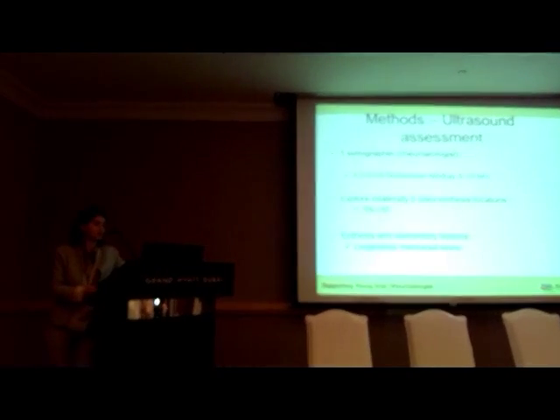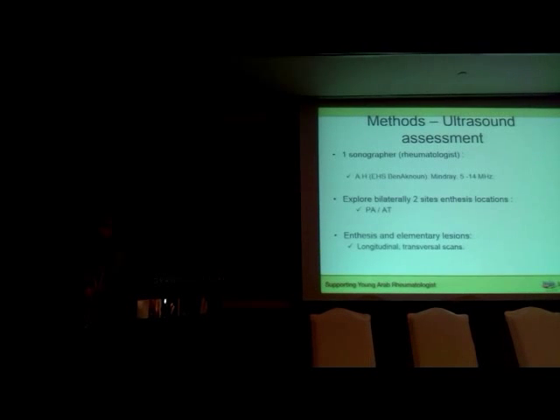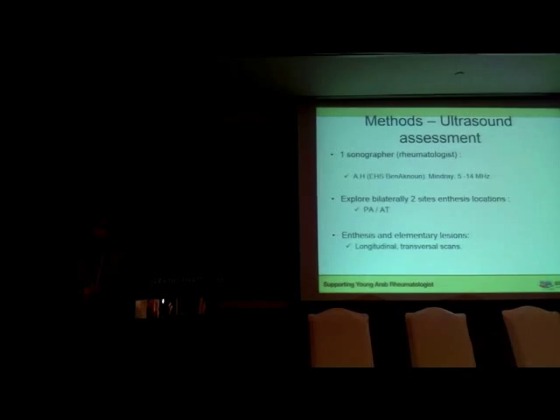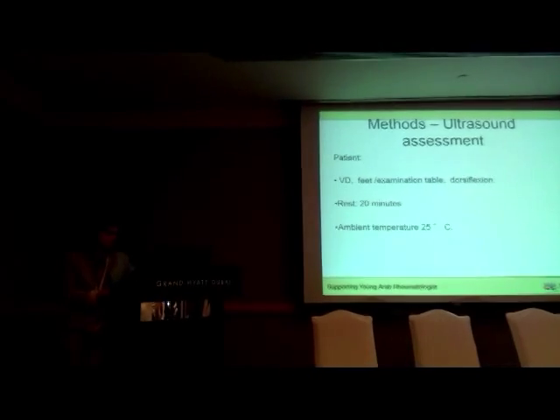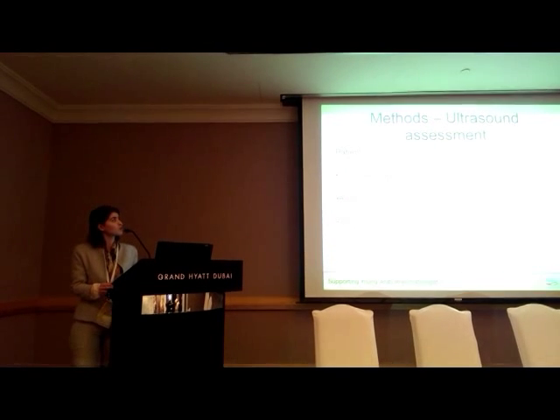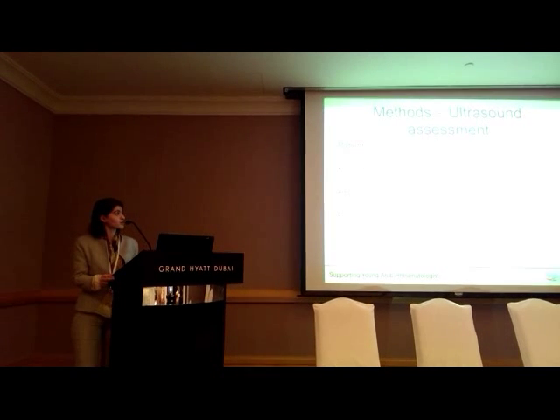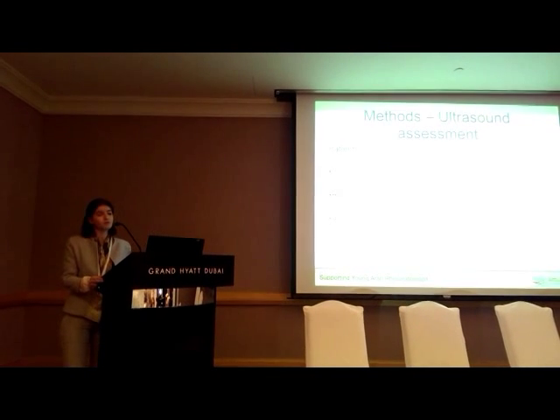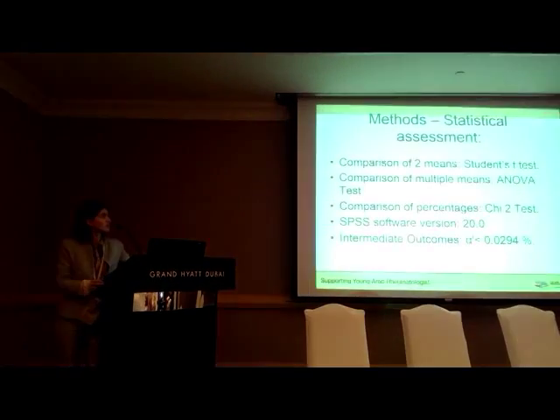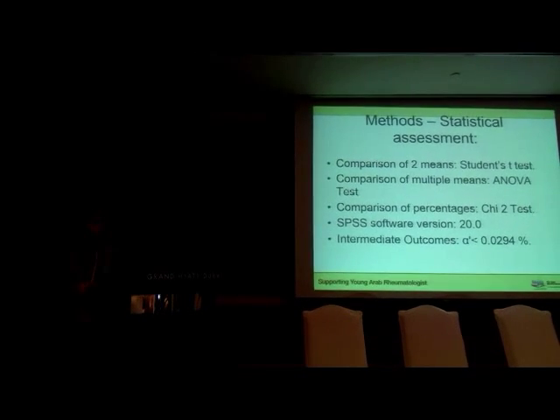For the US assessment, we explored bilaterally the PA and AT on a longitudinal and transversal scan by the same sonographer. Patients were positioned in ventral decubitus, feet apart off the examination table with a slight dorsiflexion, after a rest of 20 minutes at 25 degrees temperature. All statistical assessments were conducted using SPSS software.